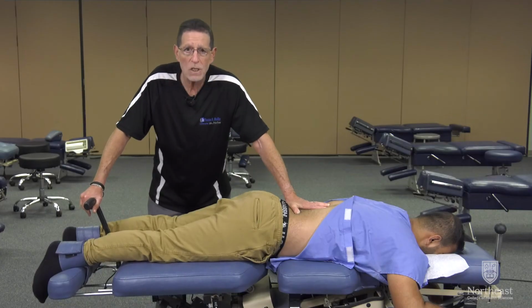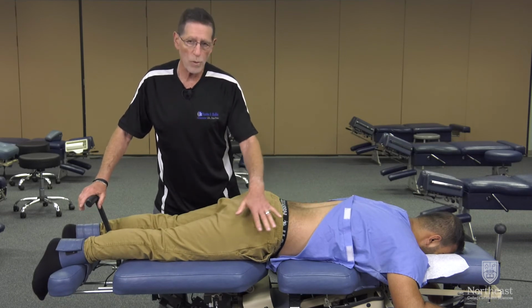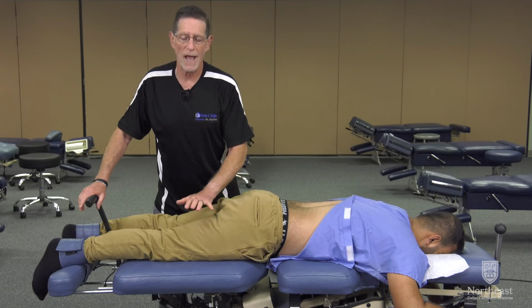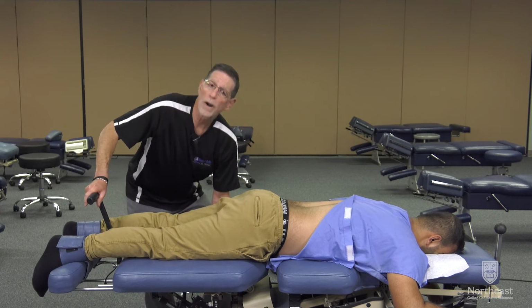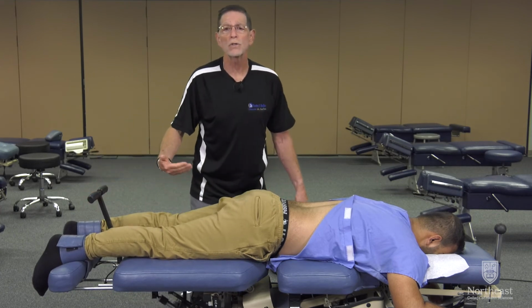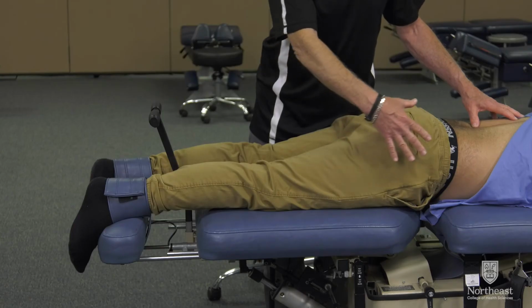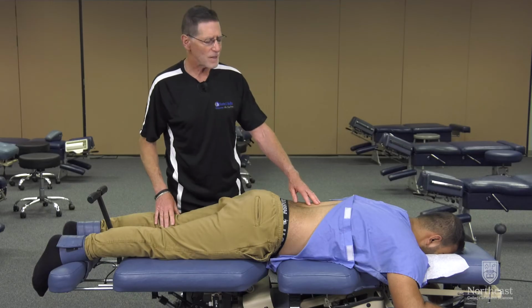After the 5 repetitions, we would ease off, and with a minimum of a 10-second rest, we would repeat that 2 more times for a total of 3 sets. And that would complete Protocol 1. Again, that's for a patient with an acute or severe discogenic radiculopathy, which is the nerve roots in the lower back causing pain into the extremity.